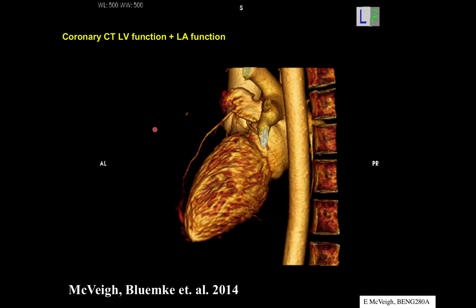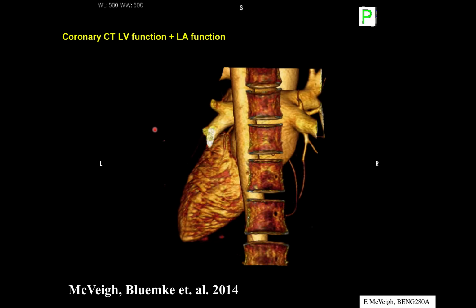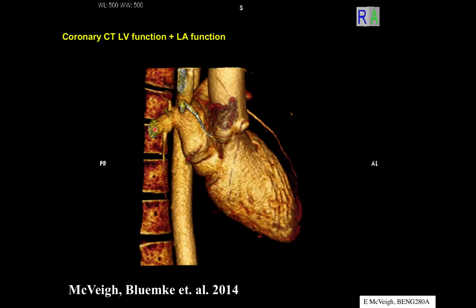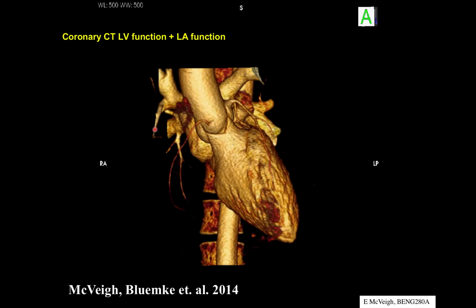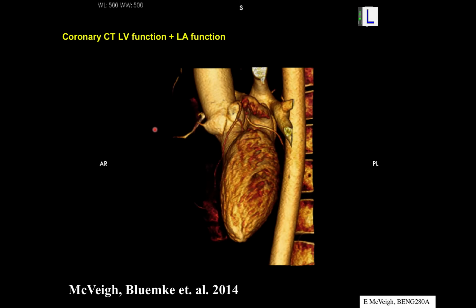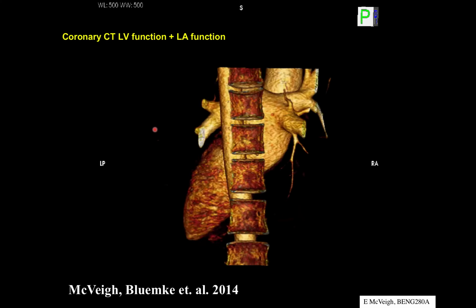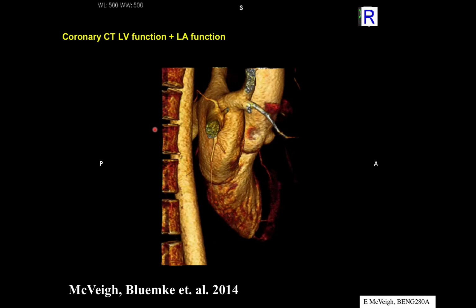This is CT data that's taken dynamically. You can take it continuously in time, and then you reconstruct images, say at 100 millisecond intervals, and then you play those images back just as a movie, and there you've got a beating heart on your screen.